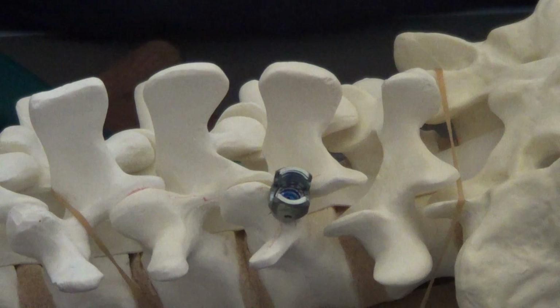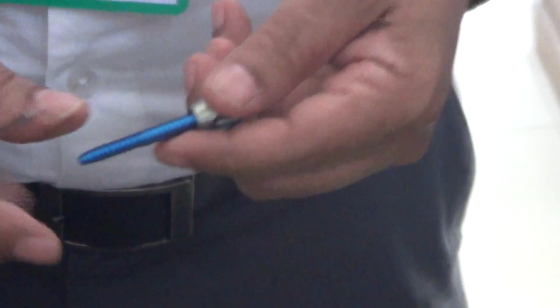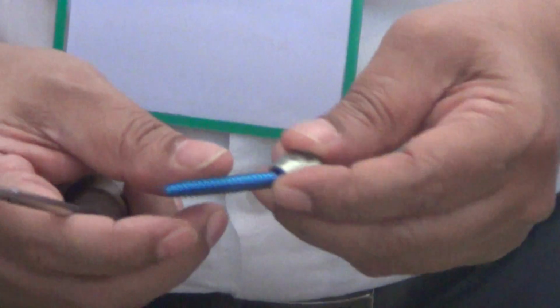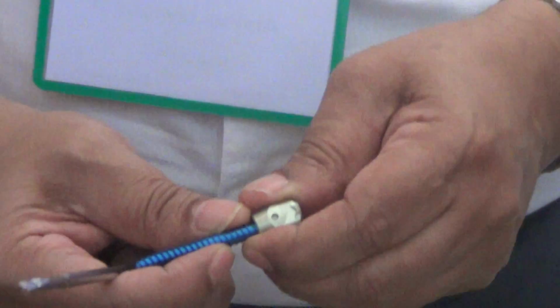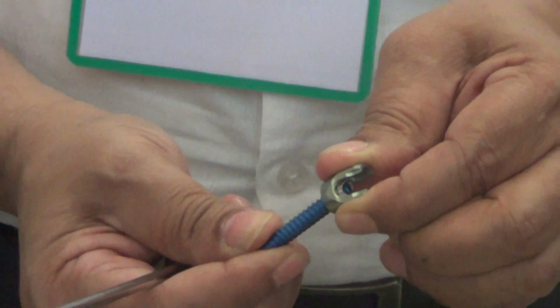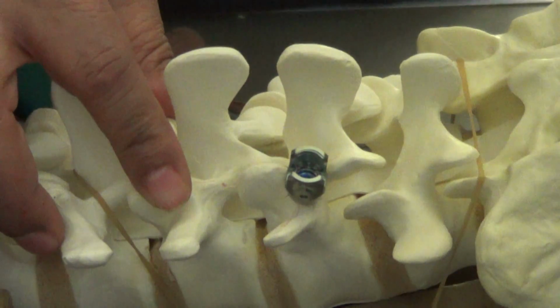If you have more of your threads coming out, the chances of breakage is much more, right? Because of mechanical advantage there, this is not stronger, and it will angulate. So the base of the tulip should sit at the bone. Right? If you drive it too much, then the polyaxial screw will become monoaxial. So just at the base, you should just bend the way. That's the most stable position.